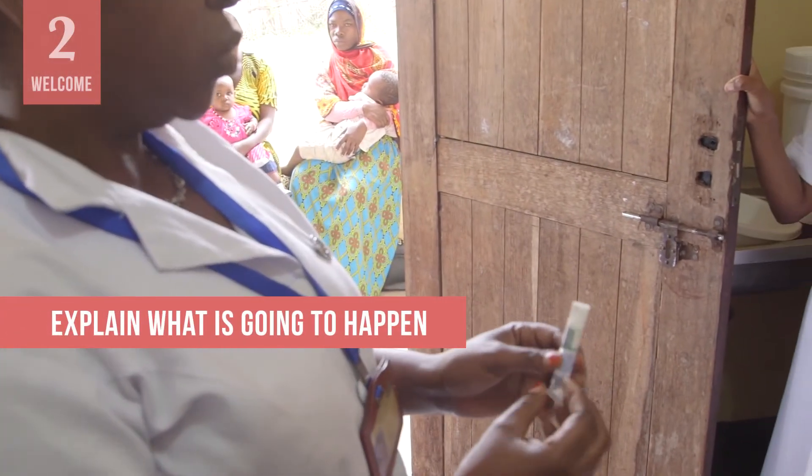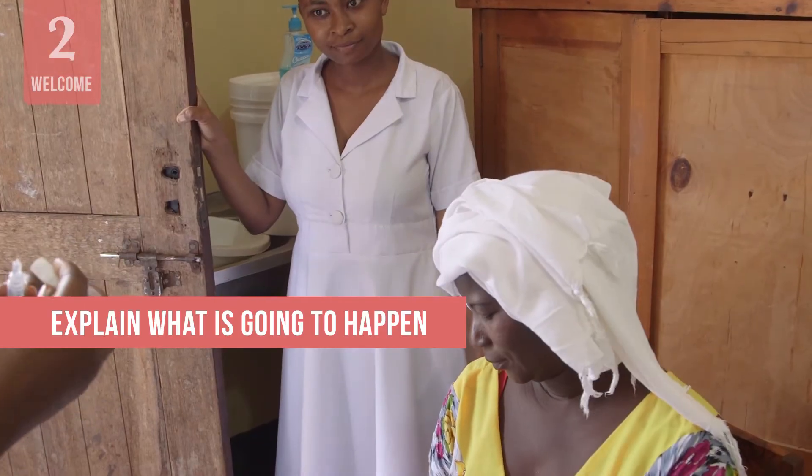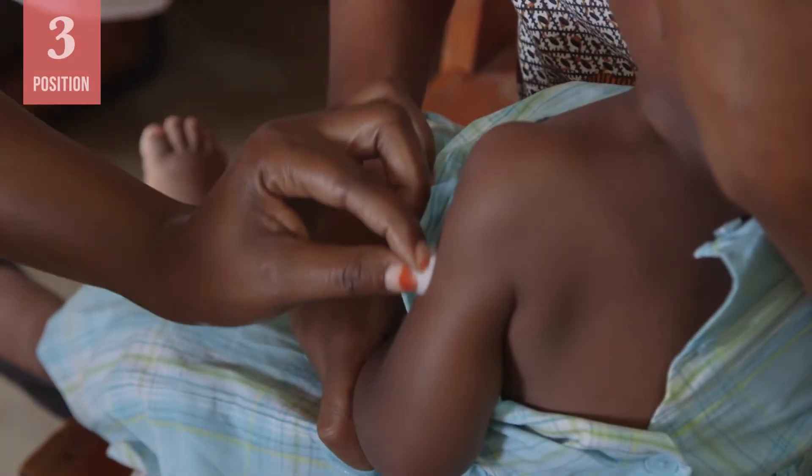Explain to the caregiver what is going to happen and talk with them about the best way to position their child. Let them know that holding their child properly will help keep the child calm and still, which will make the immunization go more smoothly. There are five different vaccination positions; the one you choose will depend on the number of vaccines to be given, the age of the child, and what is easiest and most convenient for you.